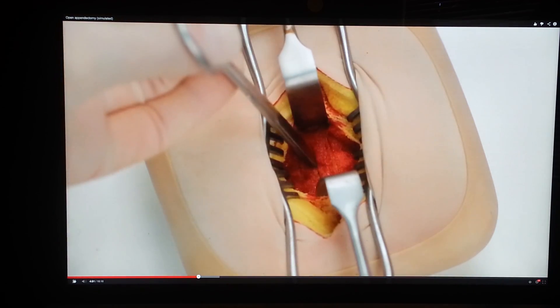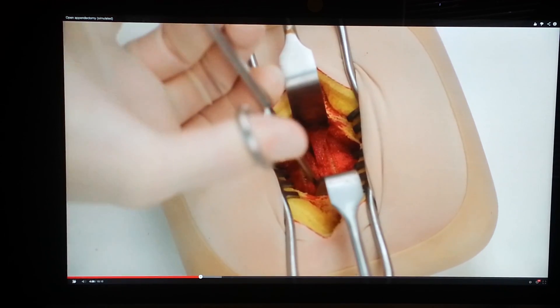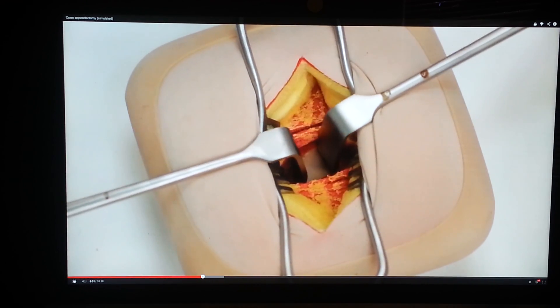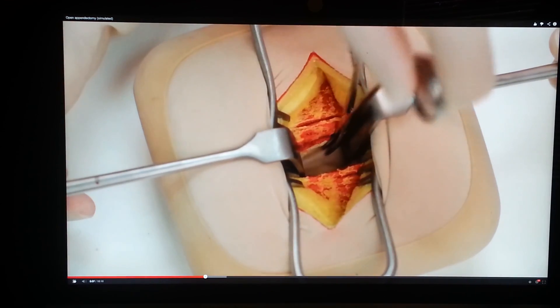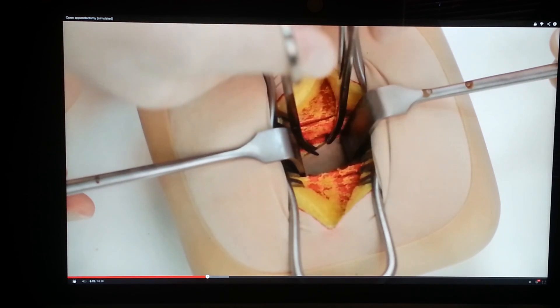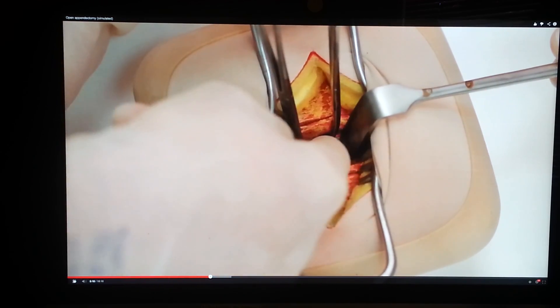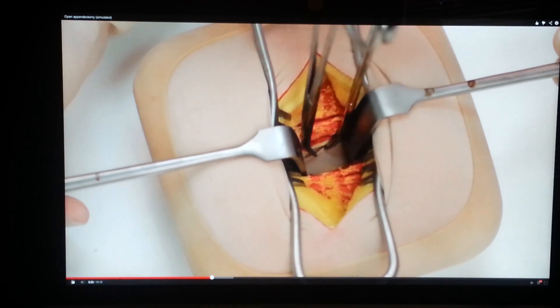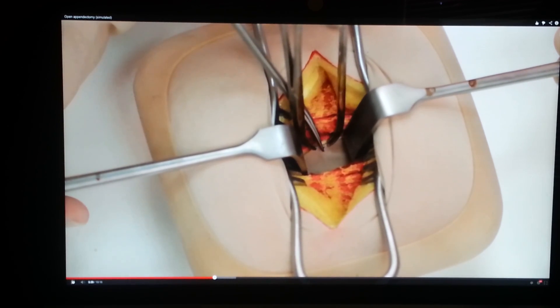Transversus abdominis should also be split in the line of its fibres. Beneath this muscle, the fused transversalis fascia and peritoneum will be visible. Apply two mosquito forceps to a fold of peritoneum and ensure that only peritoneum is held by pinching it between your fingers. Make a small incision in the peritoneum using either dissecting scissors or a knife and enlarge the hole in the line of the skin incision.